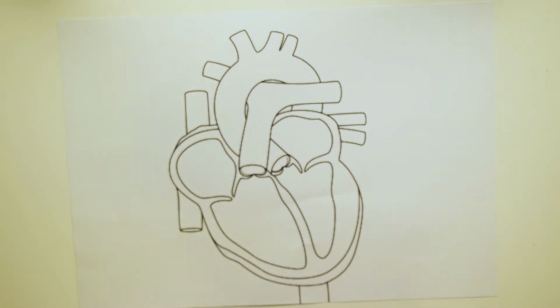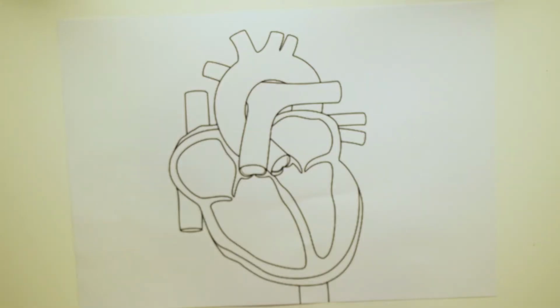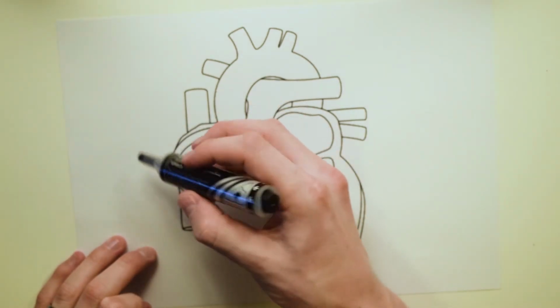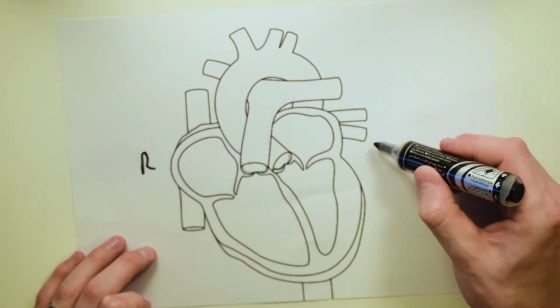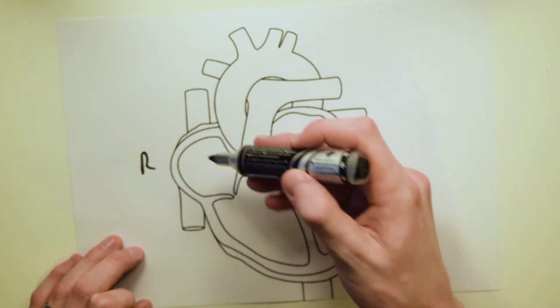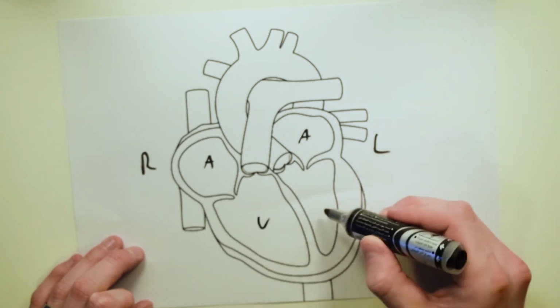Alrighty, so if you want to understand an ECG, you need to first understand this. And when I say this, I mean the electrical conductivity of the heart. So this is the right-hand side, and this is the left-hand side. Patient's left, patient's right. So these are your atria, and these are your ventricles.